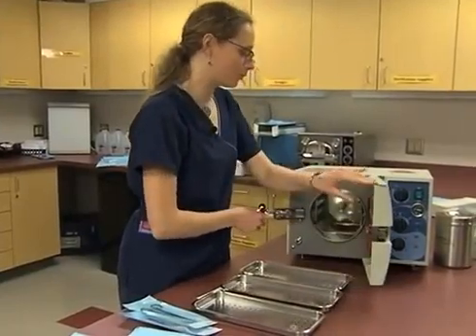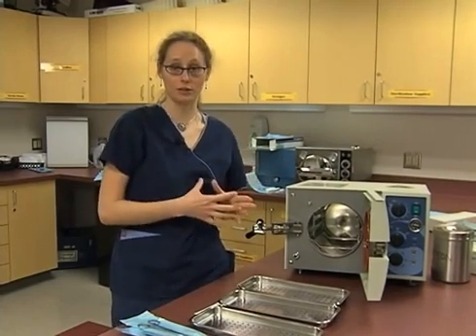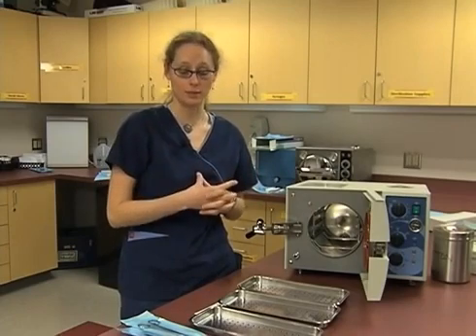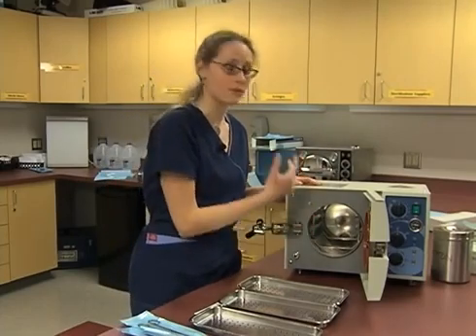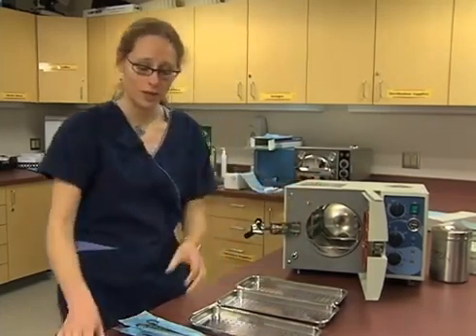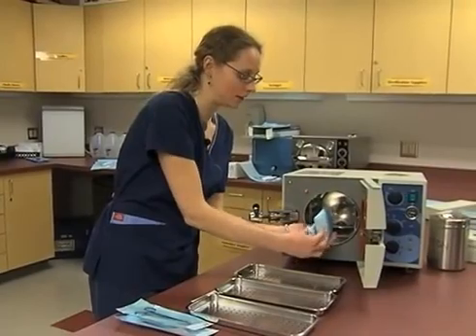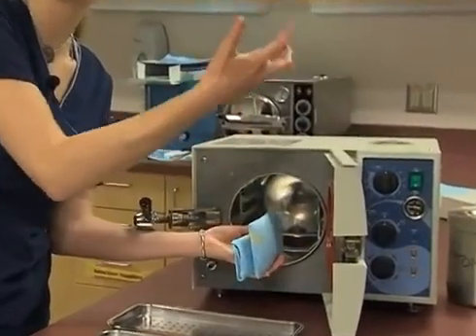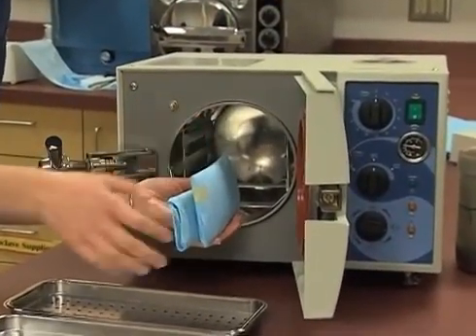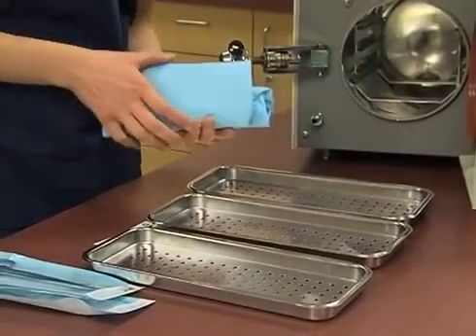Just like when we were wrapping our instruments, we want to make sure that all surfaces are going to be heated by the steam inside the autoclave. So all surfaces have to be touched by that steam, and they all have to be evenly distributed in the autoclave. Some autoclaves will merely have a chamber that you must fill. In that case, you would want to stack your items in there, have enough items, so that everything is arranged in a fashion that the steam could flow up through and around all of your packages. Other autoclaves offer trays to make sure that there's even airflow between all of your packages.